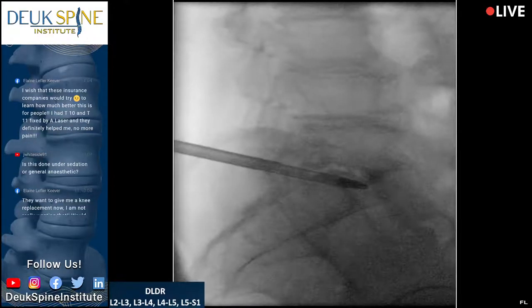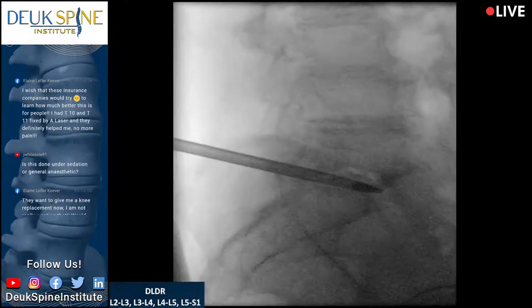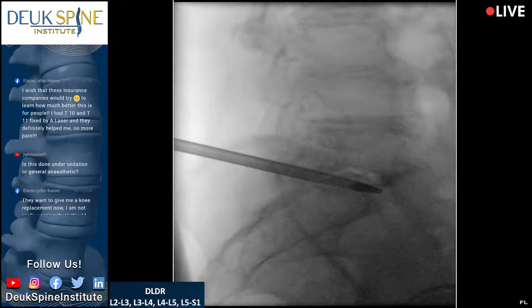Instead of doing open surgery, this patient didn't want a fusion or open surgery, so he chose to do endoscopic surgery. You're doing great. Just lay still. Almost done. Is he uncomfortable with his neck position or what?